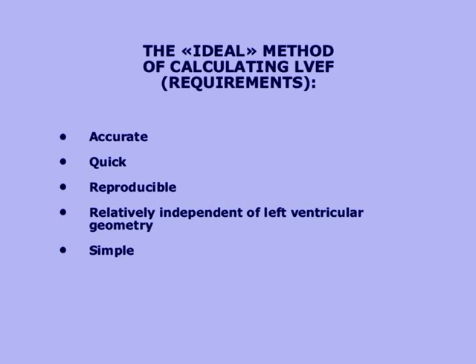An ideal method of calculating ejection fraction should be accurate, reproducible, simple to perform, and applicable to patients both with and without regional asynergy.